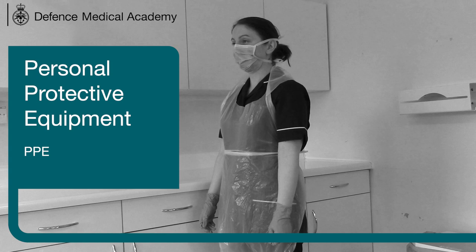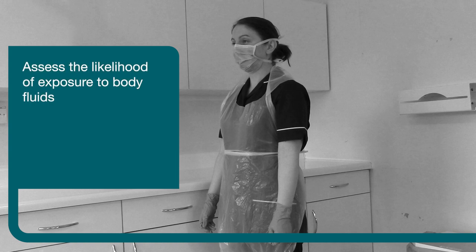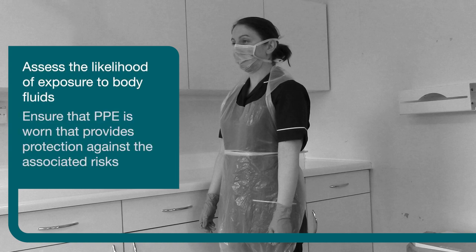This short video will demonstrate the correct order for putting on or donning and taking off or doffing and disposing of PPE, or personal protective equipment, for healthcare workers in the primary healthcare setting. Adherence to this procedure will help you to prevent cross-contamination to healthcare workers, to yourself and to the environment. Before undertaking any procedure, staff should assess the likelihood of exposure to body fluids and ensure that PPE is worn that provides adequate protection against the risks associated with the procedure or task being undertaken.